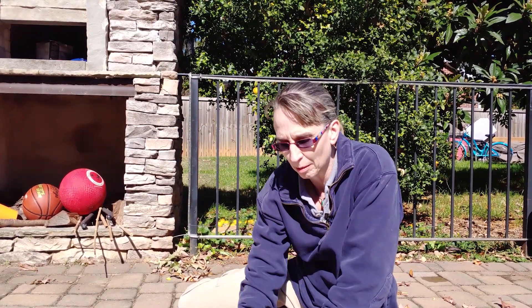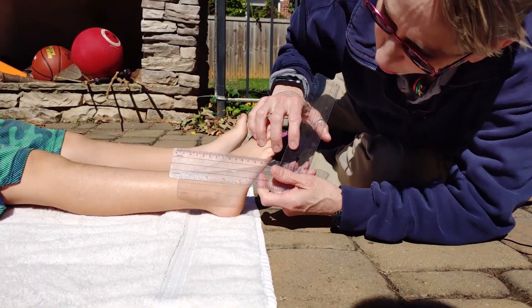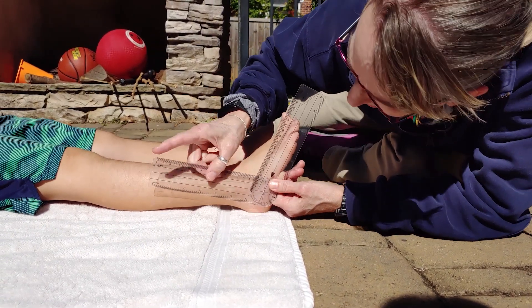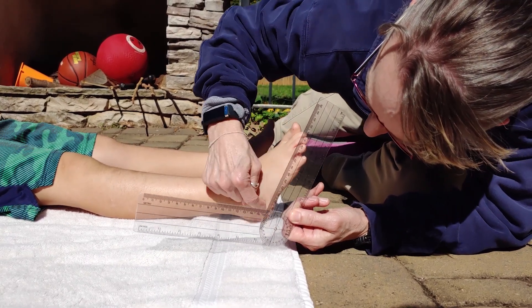I'm going to use a goniometer, so I'll show you how it's done. I get this line even with the bone that goes along here, the tibia, and I have this line along the edge of the foot right up through here.